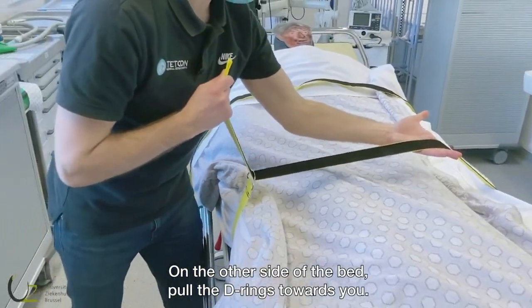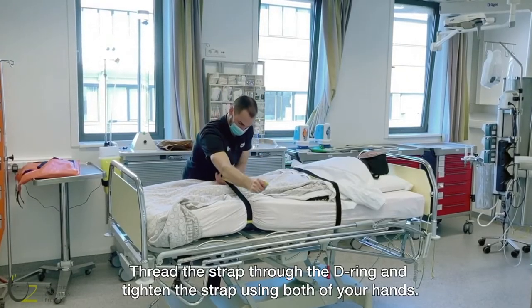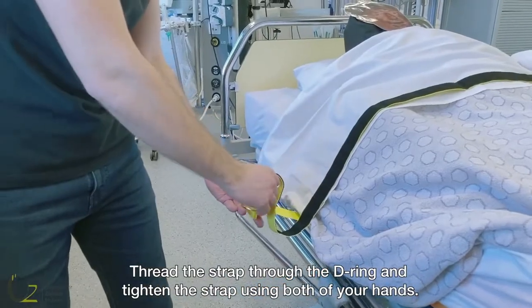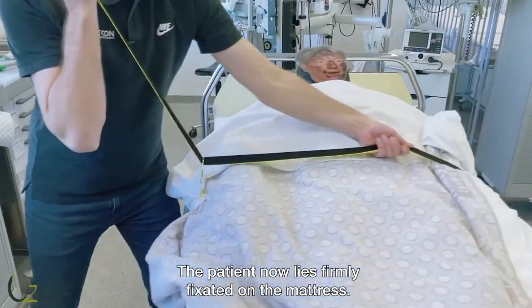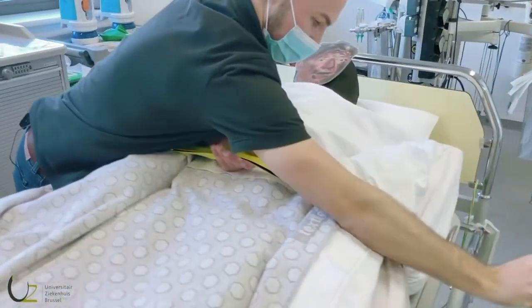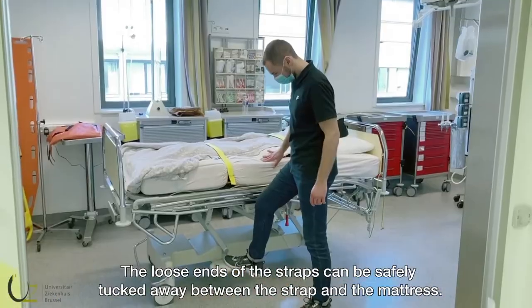On the other side of the bed, pull the D-rings towards you. Thread the strap through the D-ring and tighten the strap using both of your hands. The patient now lies firmly fixated on the mattress. The loose ends of the straps can be safely tucked away between the strap and the mattress.